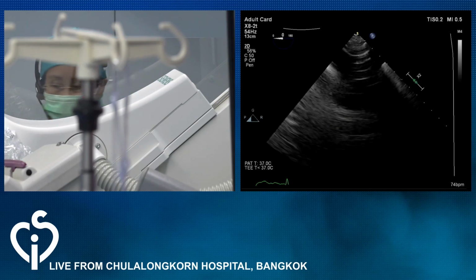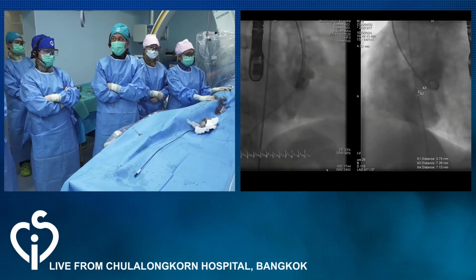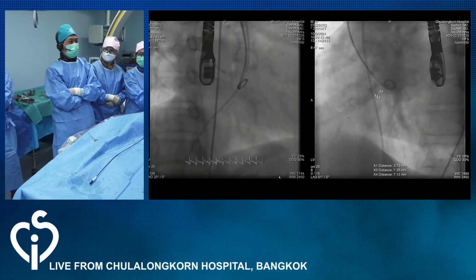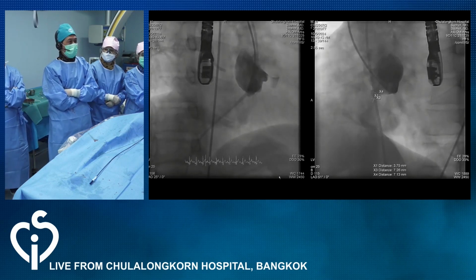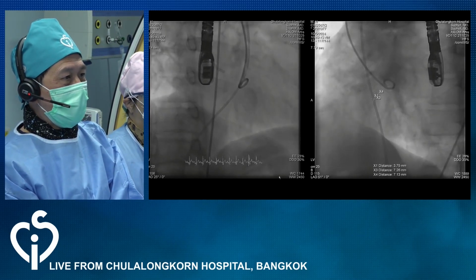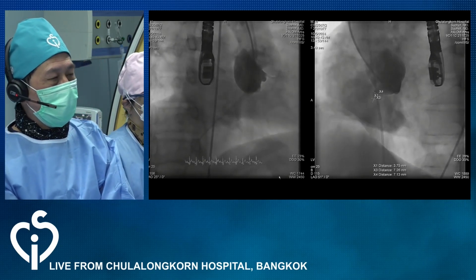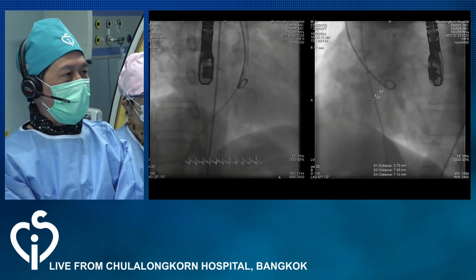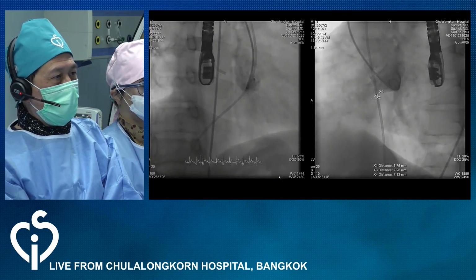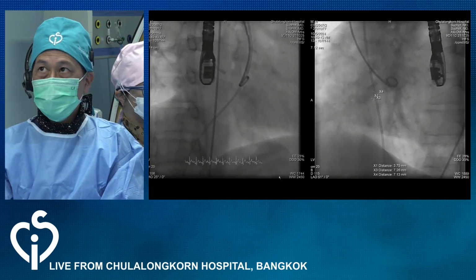Yeah. And this is another angio. I'm not sure whether you see the angio or not. Yeah, now we do. After we put the catheter across the defect, we make another angiogram, and we measure it's about 7.2, 7.1, something like that, for the opening. And for the rupture size, it's about 4 millimeter.